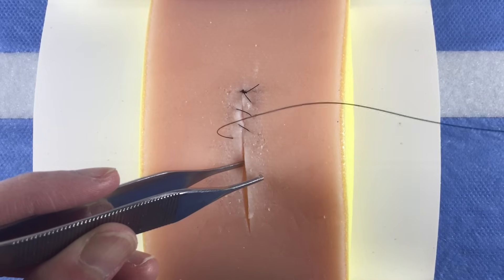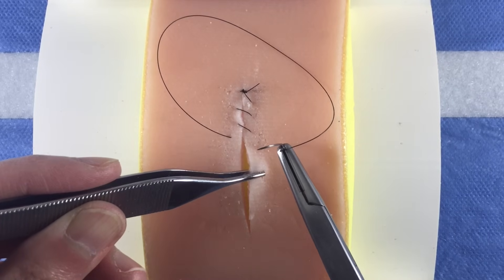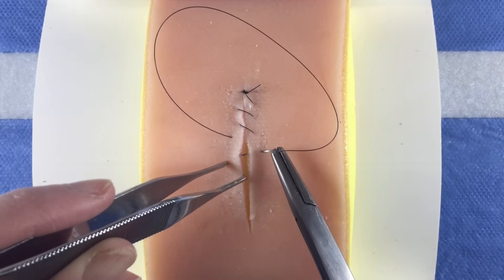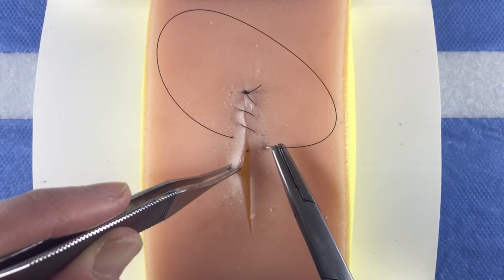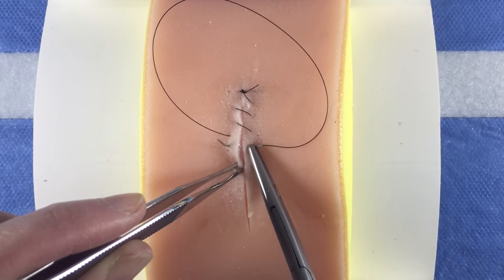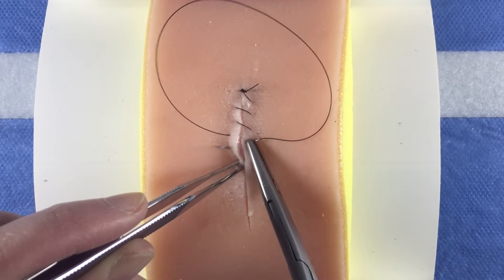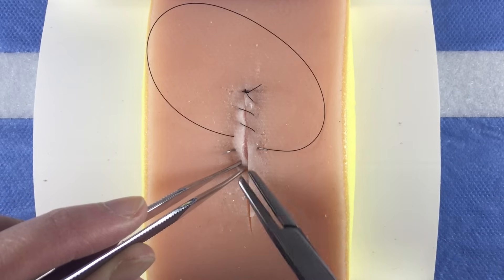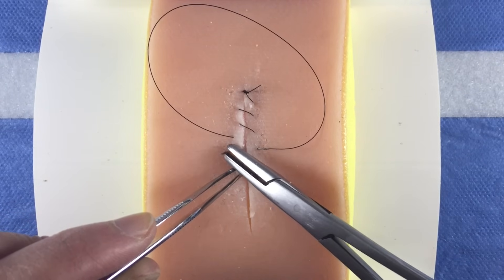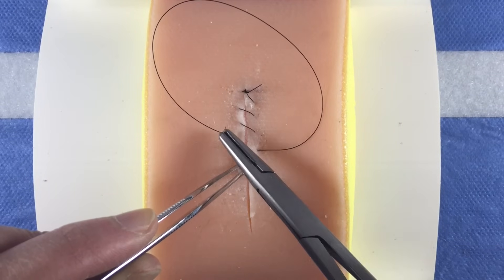You may use a forcep in your non-dominant hand to help direct the course of the needle by grabbing and stabilizing the skin edge or by placing counter pressure on the skin. Some attendings may discourage you from grabbing the needle with your forcep. If this is the case, use your forcep to grab the skin edge near where the needle is exiting. This will stabilize the needle.